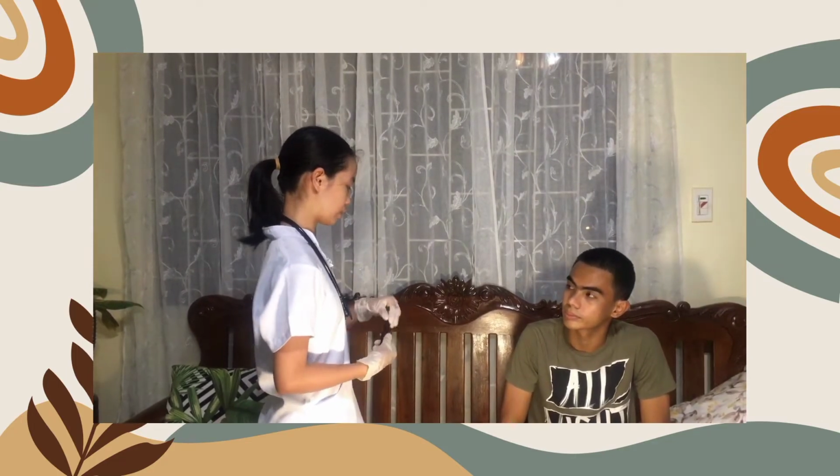The next part of our assessment is to check the red reflex using an ophthalmoscope. And assuming that we have already done the procedure, the normal red reflex is easily visible, and the red area should appear round with regular borders. Okay, let's proceed with the next part, sir.